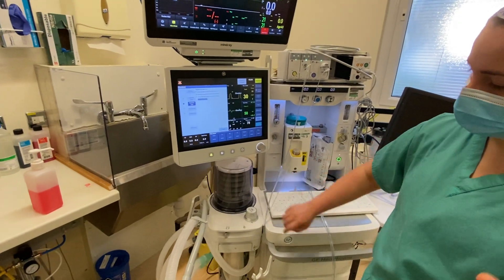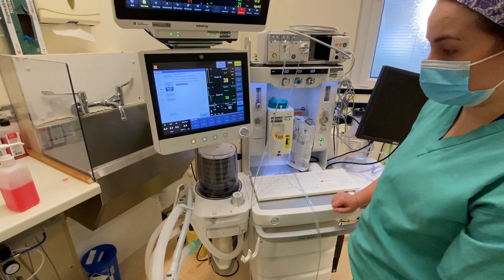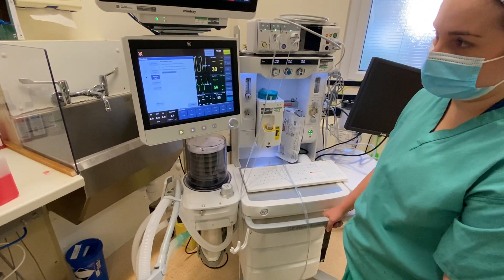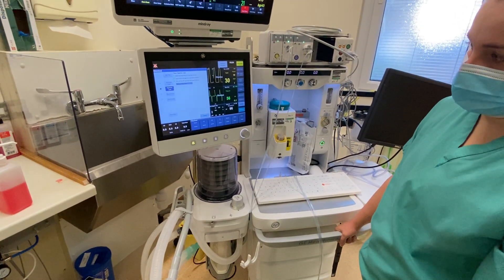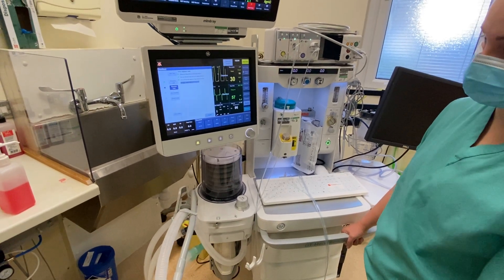All these tests are basically testing for leaks — making sure that we can ventilate automatically through the machine without there being any leaks throughout. This is the longest bit of the test, which is never a bad thing.